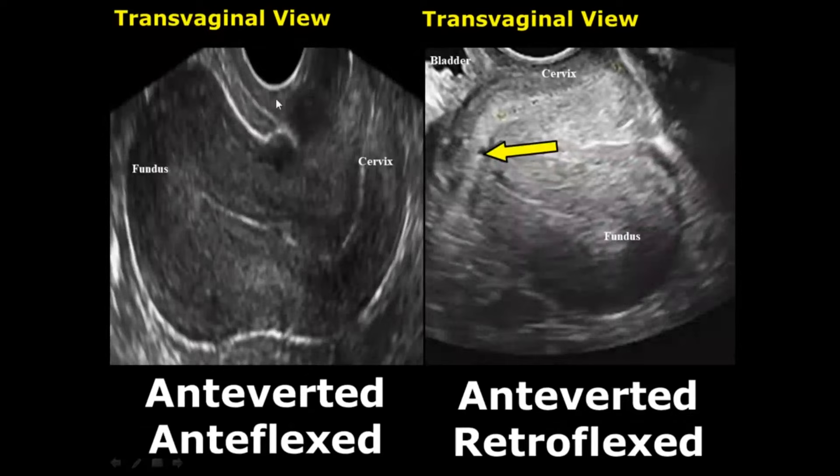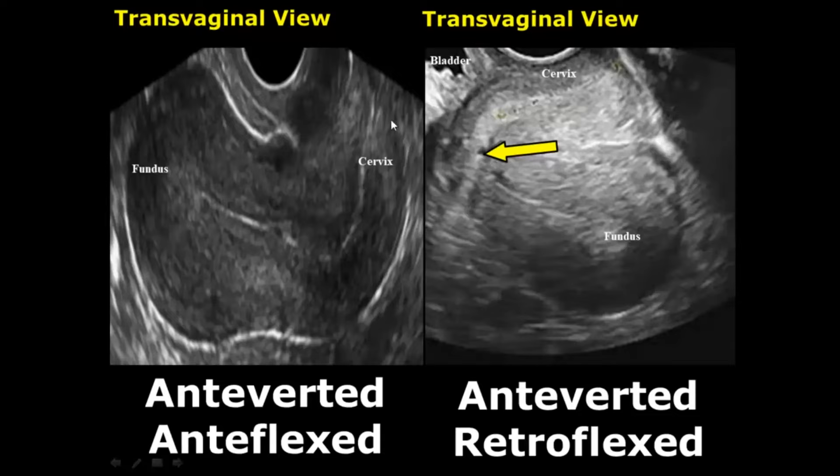Here we notice two things, that's why we use two terms: anteverted — the cervix is facing anteriorly or upward in this image — and anteflexed — the body of the uterus is bending anteriorly. The bladder is supposed to be in the top left corner of the image.